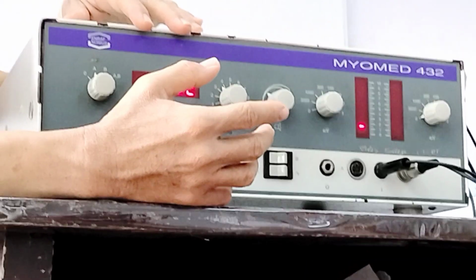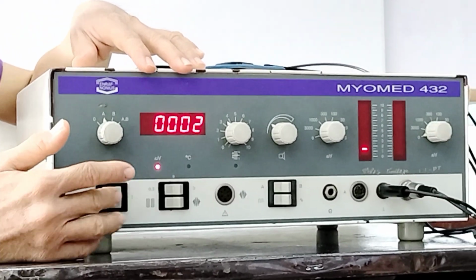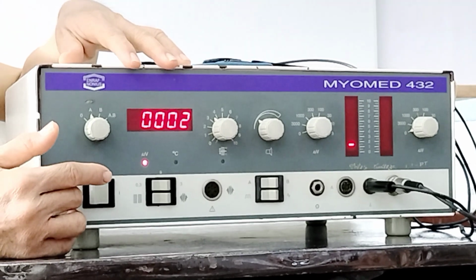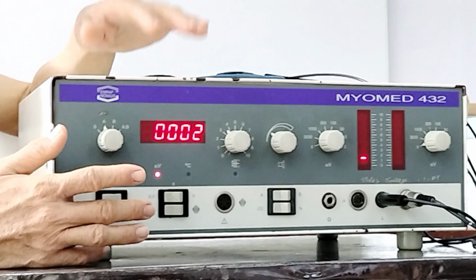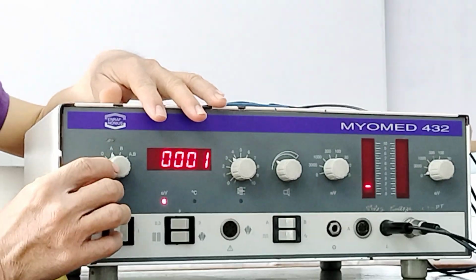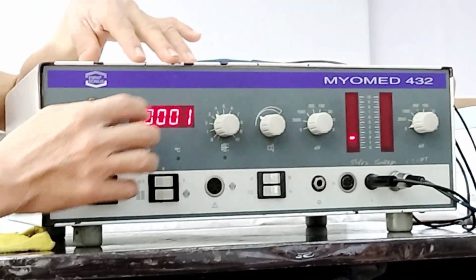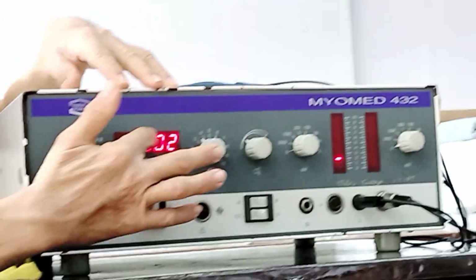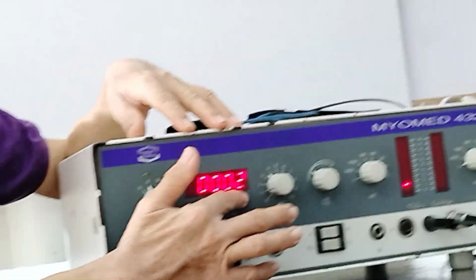Okay. So here, with regards to this device, again this would be your switch on and off. So 0 is the symbol for off, vertical line is on. So when you switch that on, it is on. Okay, here is the selector knob used to select which channel we want to display here. These display certain values there.